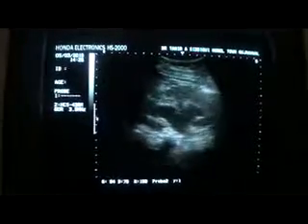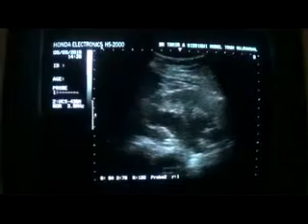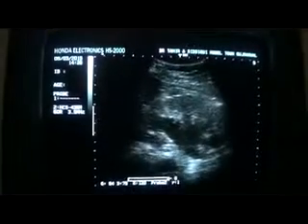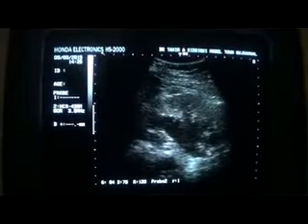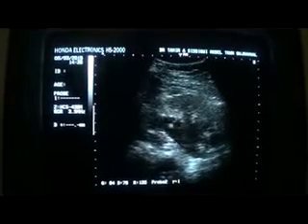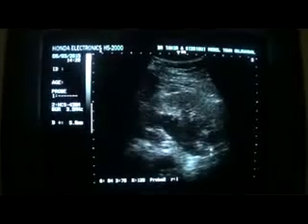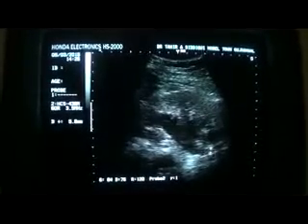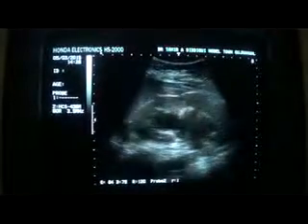This is the spleen. And the proximal ureter in this region, in the left kidney, does not show that much of a dilation that we saw in case of the right kidney. This is the proximal ureter from the pelvis, and here it measures only 5.6, it's less than 7. Here the proximal ureter is not dilated. So there you go.